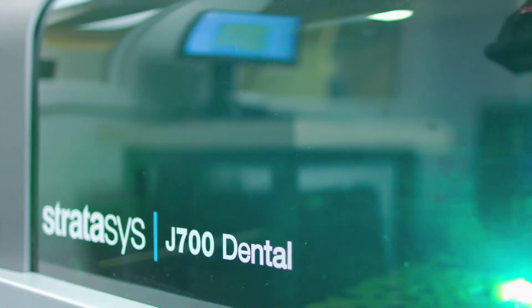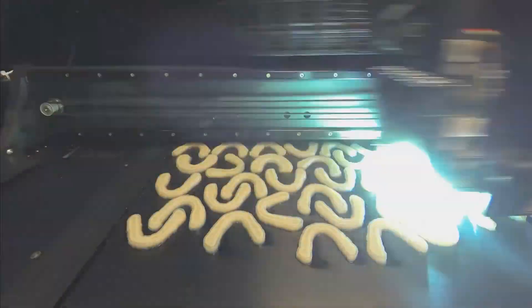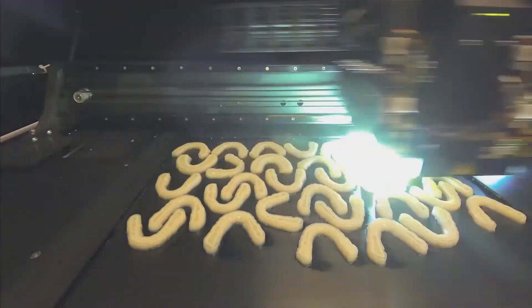The J700 came along and it was evident that this would be the right printer for us. It can maintain our quality levels but at the same time it could increase the speeds by 1.8 times. The build tray size will handle about 55 arches nested and we can print those in about three hours, which is much faster than we were printing on the 500 series printers.